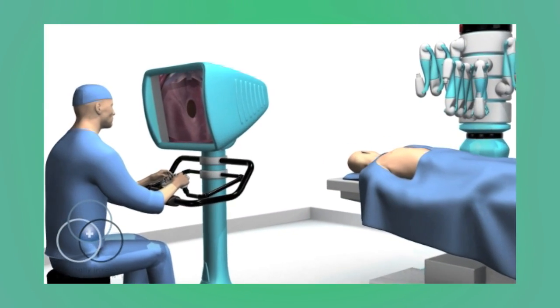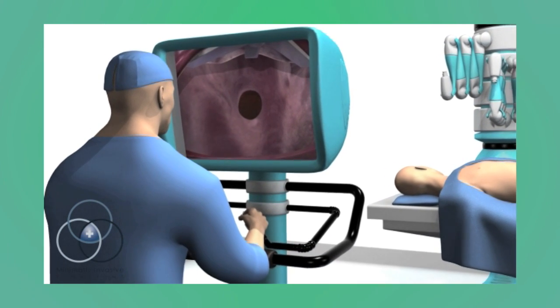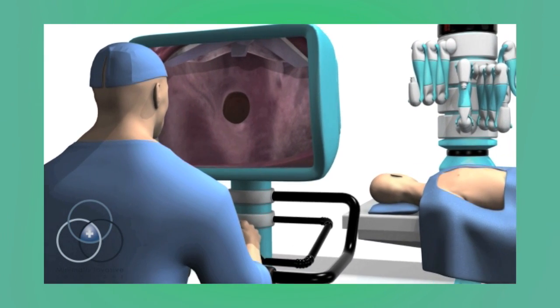The robotic atrial septal defect repair involves the repair of a hole in the wall separating the left and right chambers of the heart, called the atria.